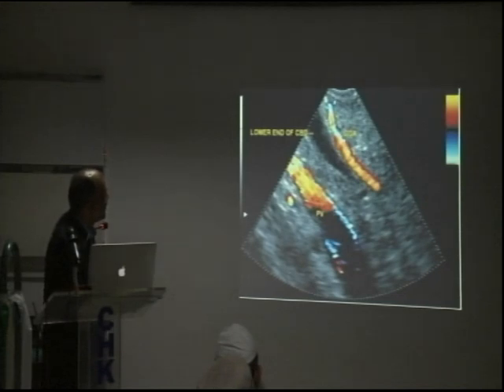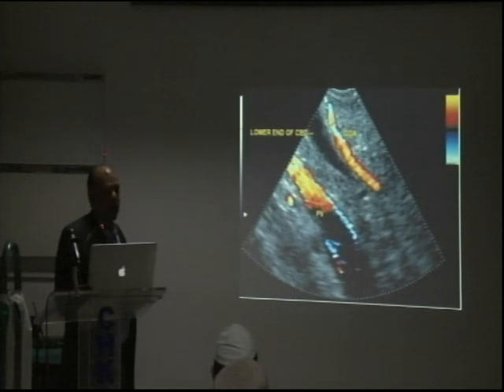So the first structure in between the duodenal wall, and I'll intentionally cut this side. So GDA, common bile duct and portal vein, and what is this structure? Yes, very good. So it will be the hepatic artery. All right. So this should be the duodenum. And where is the head end on this side?